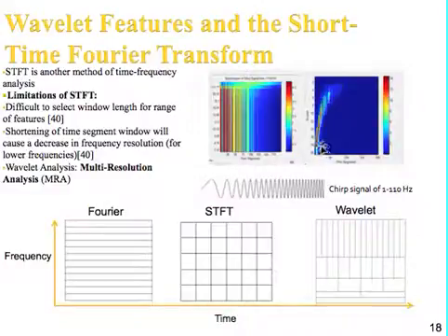If you look, however, at the wavelet analysis, you can actually see the shape of the chirp. You can see the frequency content evolving in time from lower frequency up to higher frequency. There's some broadening here as well, but not nearly as much as what we see with the short time Fourier transform, where you can hardly even tell what you're looking at.